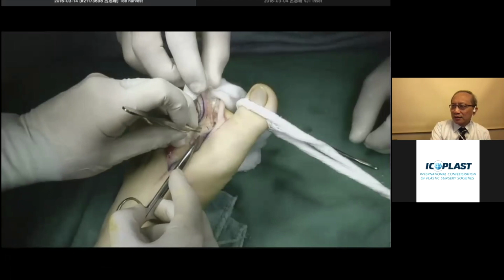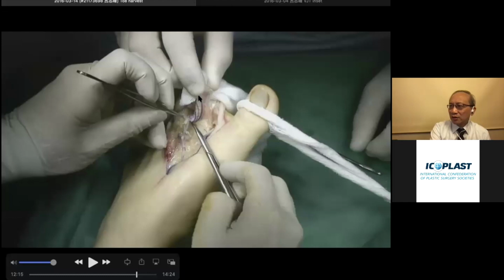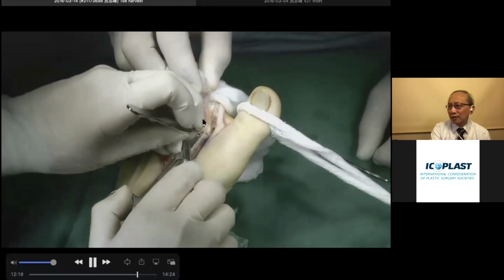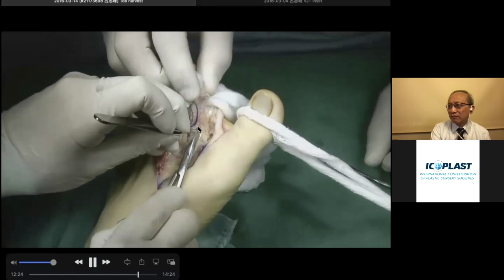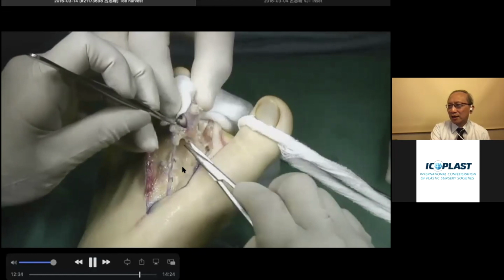So if you can do a very parallel osteotomy, that'd be easier. So veins here, artery there, we already did the osteotomy, held by my assistants, and we will remove all the other soft tissues, which do not have to be included in our prep. And there's not much vessels around here, digital artery there. Then here, actually, maybe some tiny vessels, but no big one. So we can just detach that safely, not to worry about that.